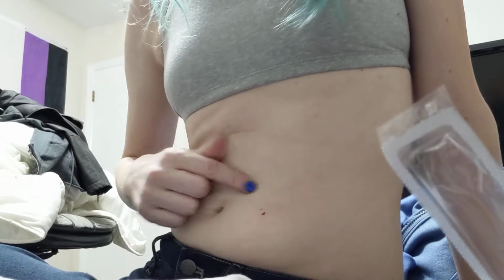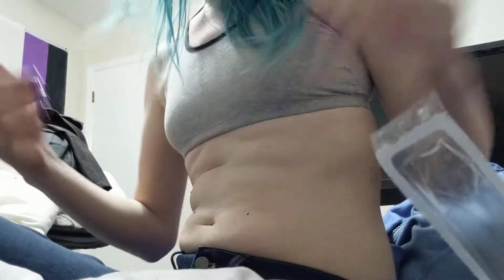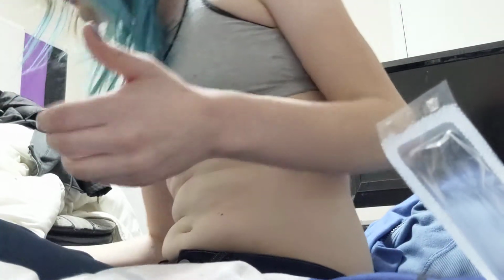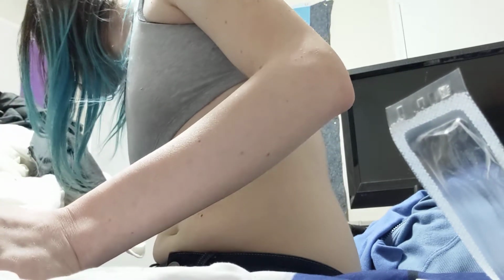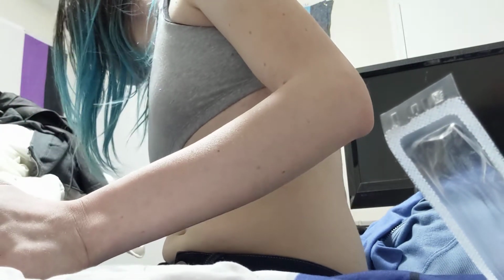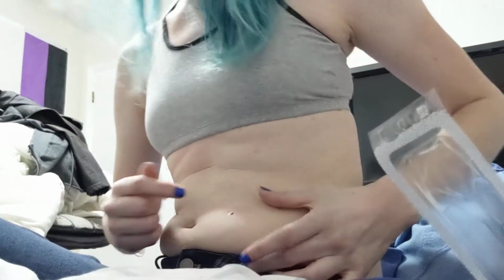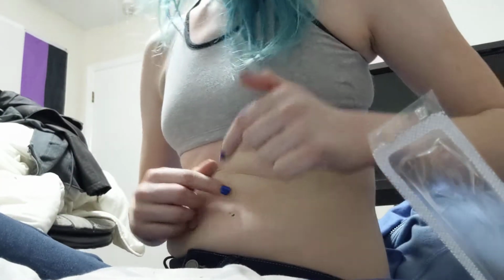and you just got that little bit right there. I'll usually just clean that off with a towel or something. I had a paper towel handy. Where'd it go? But yeah, it's okay if you see a little bit leak out. That's completely fine. It's just going to be like a tiny little drop or something like that.